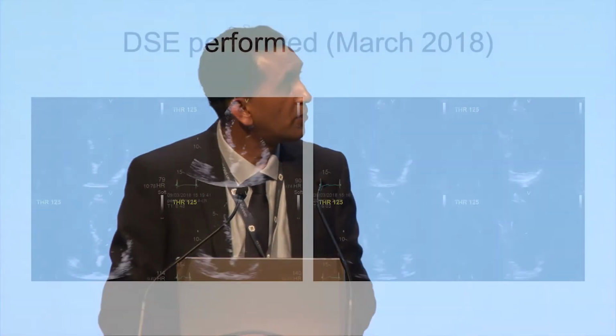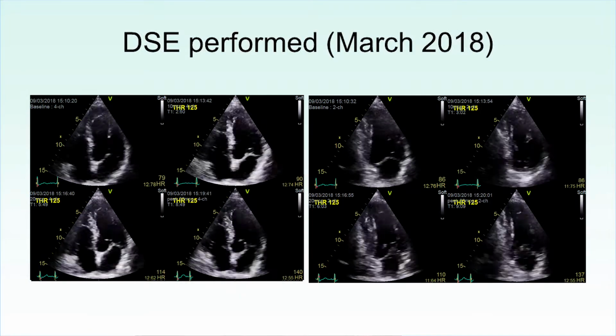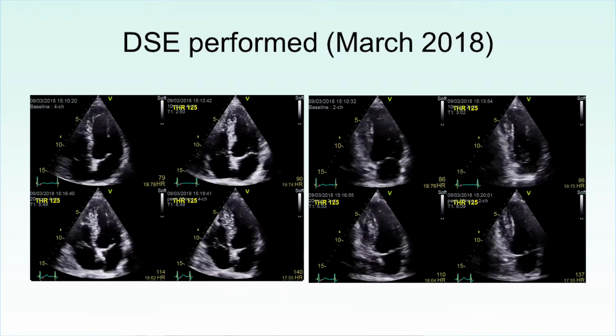He has a history which suggests that he's had an MI in the past, and he's on the medication that's indicated. This is actually very important. There is indication that this patient has had an allergic reaction, so we have to be very, very cautious on whether we use contrast or not for this patient. So the patient was seen back in March of this year, performed a stress echo.